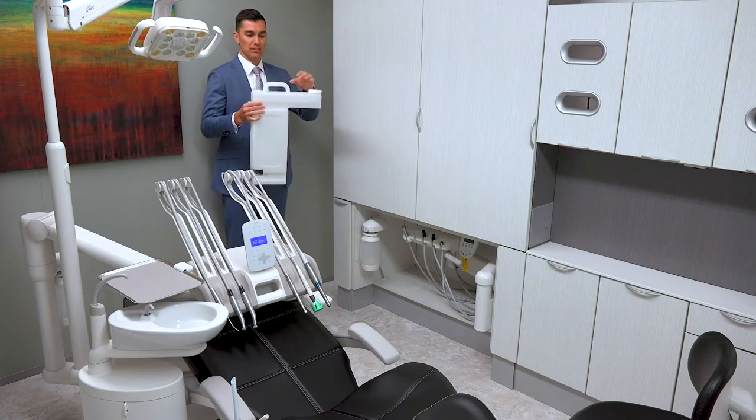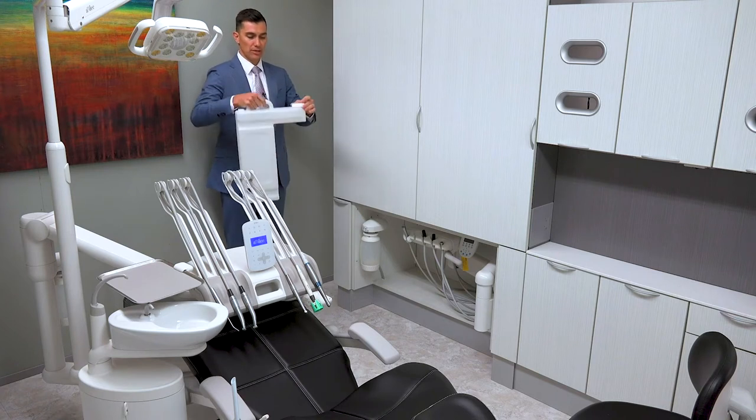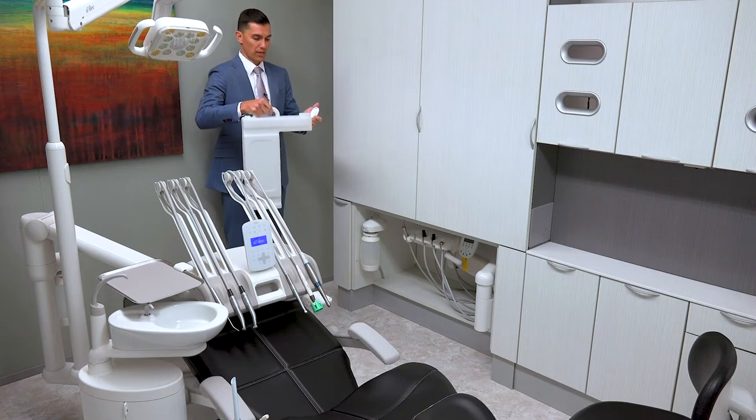As you can see, the shape of this allows for the handle to be held to put it up towards the sink and to hold it very easily. You've got your top right here where we can actually fill this tank. We'll take this tank and run it over to the sink to fill it up.